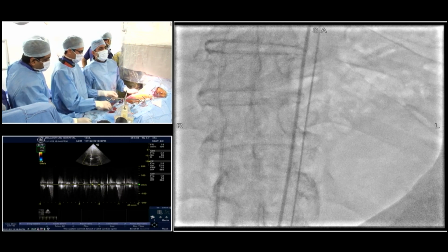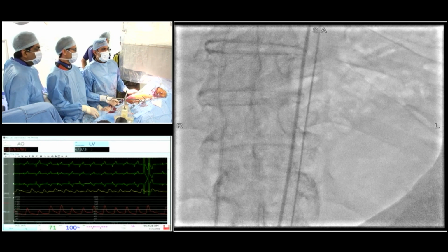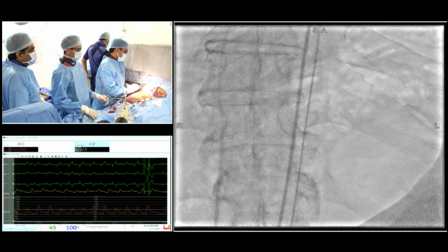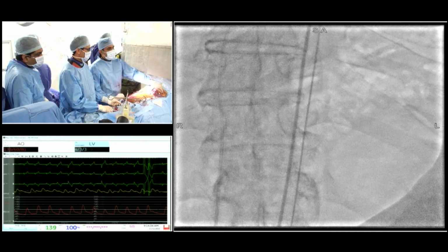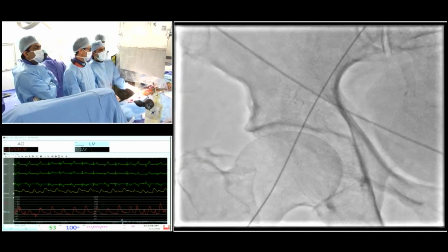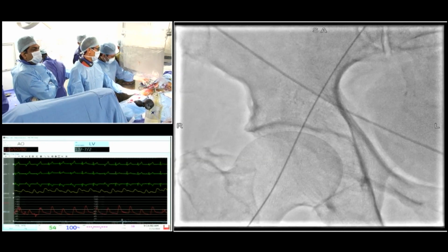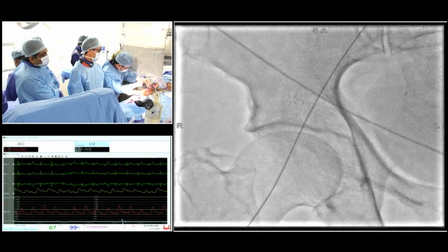Does a CT scan 100% tell you that it is a bicuspid aortic valve, or do you have problems where on table you find that it is? Almost 99 to 100%, a good quality CT will tell you the anatomy, whether it's a type 0, fused, whatever type of bicuspid. So in answer to the question, I think TOE and echo are not good enough. DSA injection, there is so much artifact, very difficult unless you have a nice anatomy. Otherwise, CT will definitely tell you.